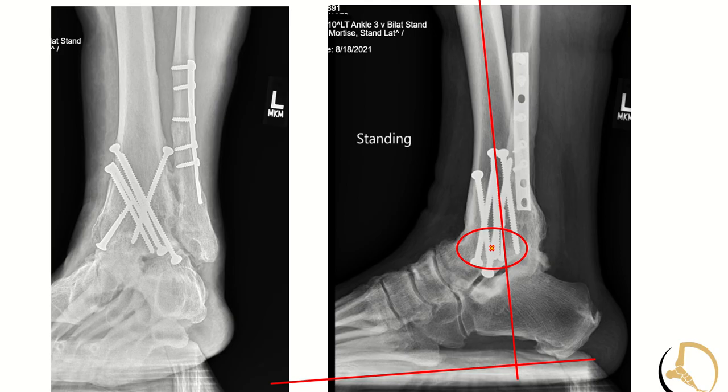One technique tip that you can do to make things easier for the surgeon: as you can tell on these fluoroscopy shots, sometimes it's hard to judge alignment. So if you just get a goniometer and have that in your pocket — it's a simple thing, easy to carry around — you can actually put that alignment up on the fluoroscopy screen and you can see exactly what your alignment looks like. You can judge your plantar flexion and dorsiflexion. It's pretty accurate and it gives you one extra point of reference that makes it really easy to see when you get into surgery.